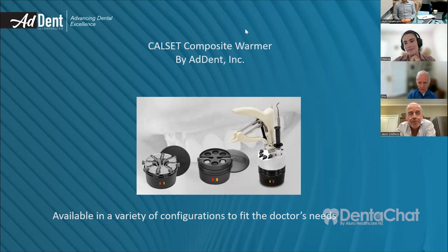The other thing is, obviously, I've been reviewing these cases for a long time now, and what I see specifically with the heated composite cases in comparison to the veneer cement cases is that you don't get ditching over time, because obviously if that margin's in the mid-facial, it's subject to fairly aggressive toothbrushing movements. And yeah, over the first 12, 18 months, it doesn't make much difference. But when you review them over 5 or 10 years, maybe 15 years, you start to see a loss of the composite resin at the margin, particularly with the veneer cements, because that's the weakest thing. Obviously, the ceramic and the tooth are a little bit more toothbrush abrasion resistant, if you will, than the veneer cement. You don't tend to see that so much with the heated composite.